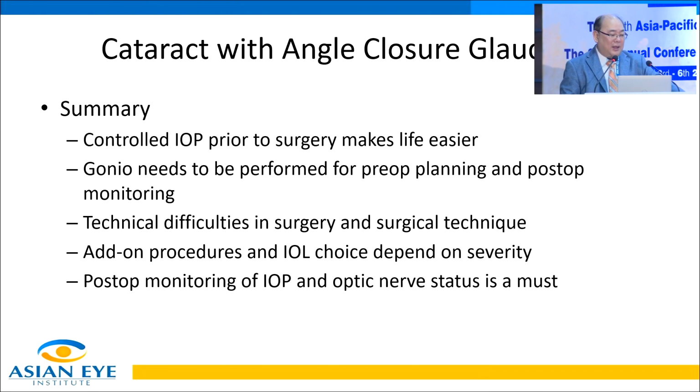So in summary, controlled IOP prior to surgery makes your life easier. We do gonio. Most doctors don't like to do gonio, but you have to do gonio at least pre-op. Adjust technical difficulties, adjust your IOL choice depending on the damage, and monitor the patients post-op.